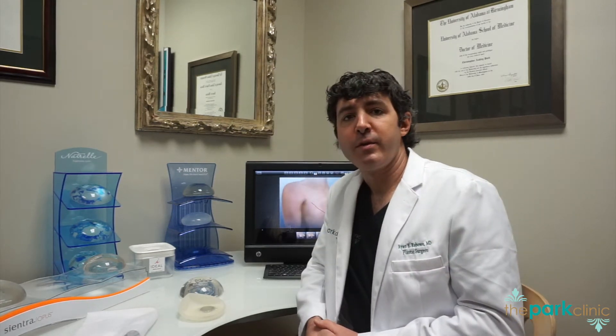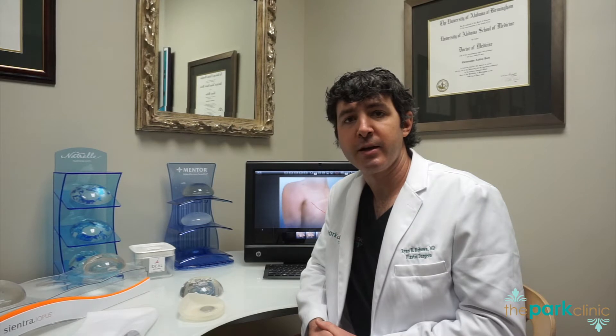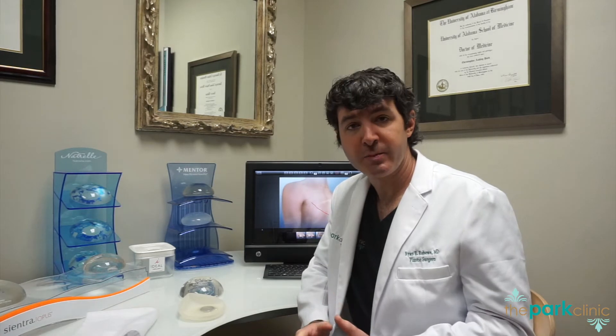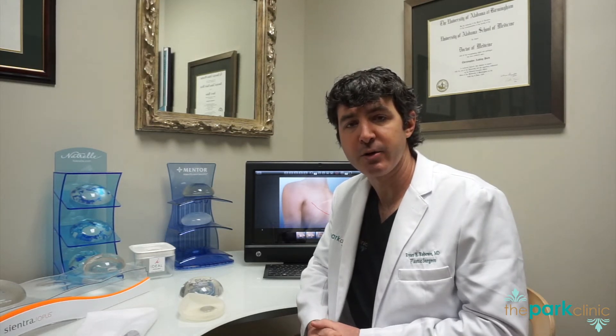Now I want to talk about one of the main forms of breast reconstruction, which is reconstruction utilizing an implant-based approach. To do this, we need to talk about two things: tissue expansion and breast implants. Your surgeon may use one or a combination of both to reconstruct your breast utilizing just an implant-based approach.